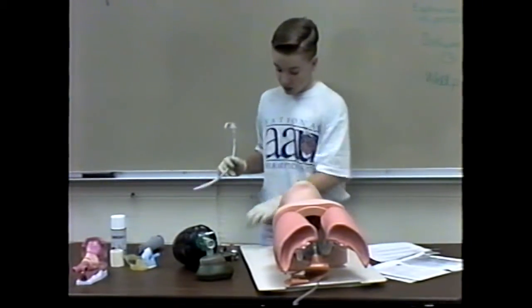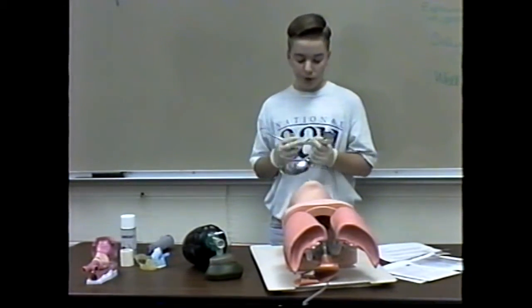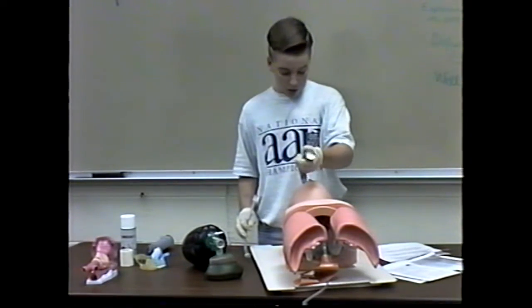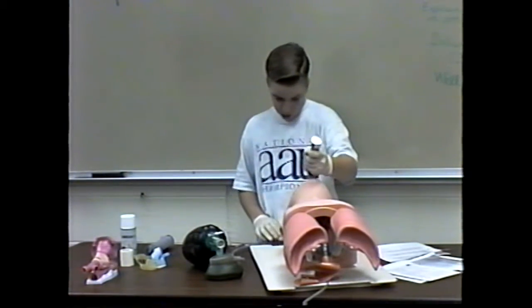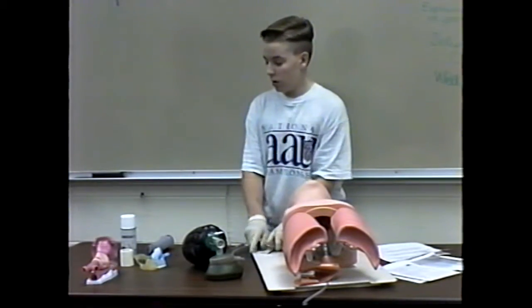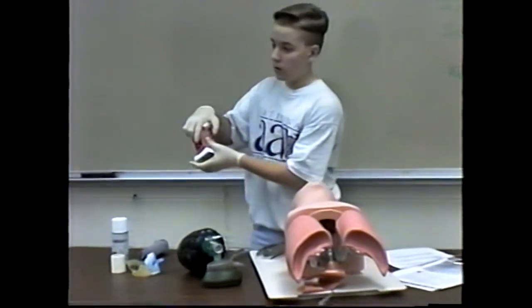And then you take the laryngoscope and the endotracheal tube, and you insert the laryngoscope into the right side of the mouth, and then move the tongue to the upper left side of the mouth until you grab the epiglottis, which is a little flap.